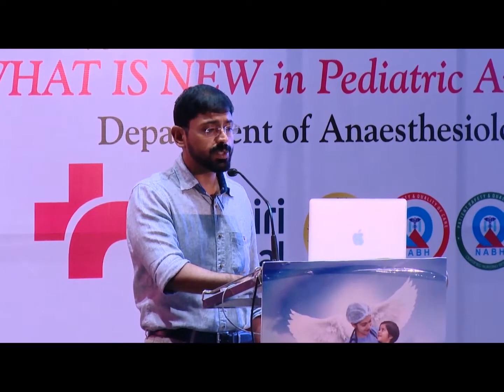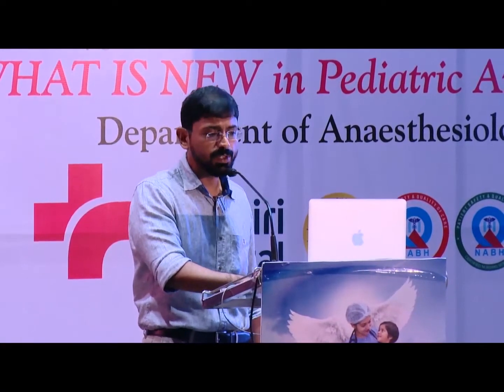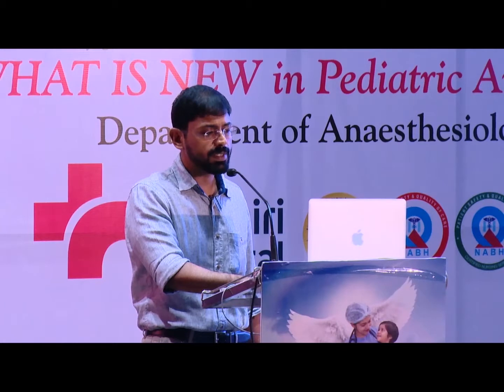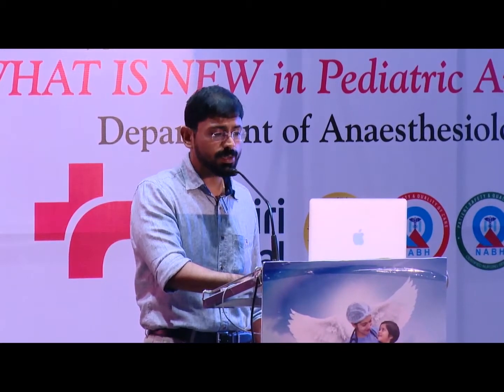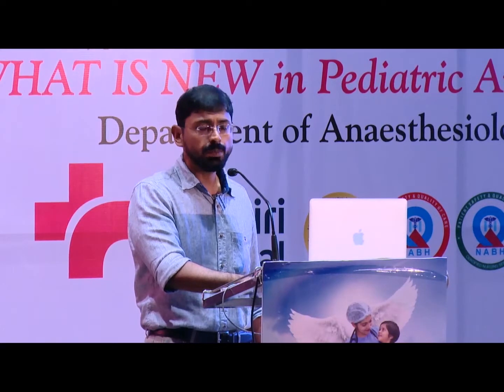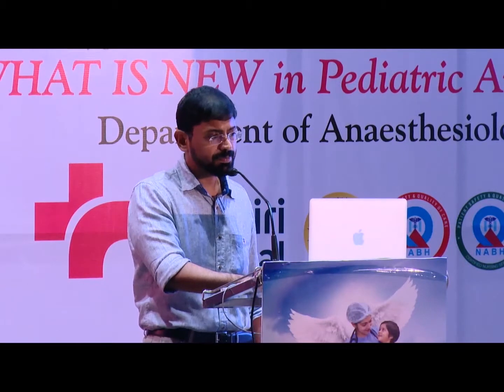The delta P is reduced further to 18. With improvement in oxygenation, the MAP is reduced to 11. FiO2 is weaned as required. And an ABG 4 hours later still shows a washout. At this point, we decide to increase the frequency from 10 Hz to 11 Hz.